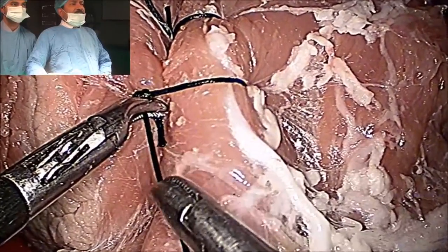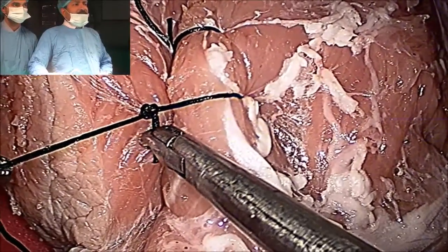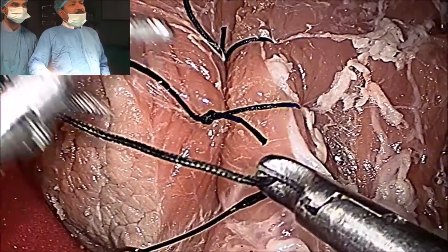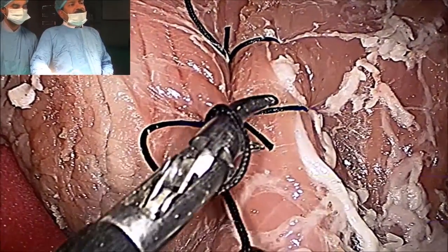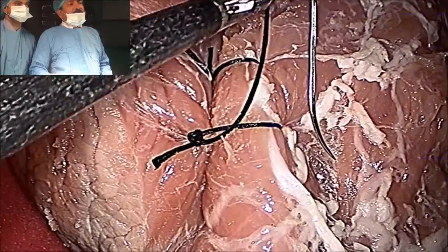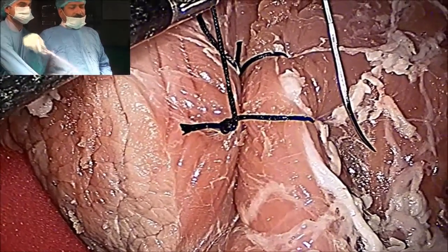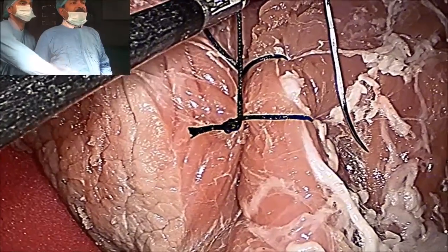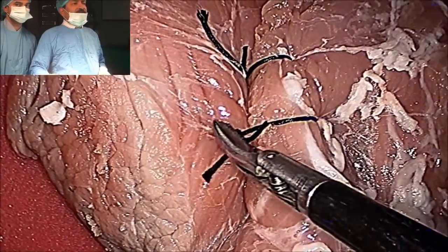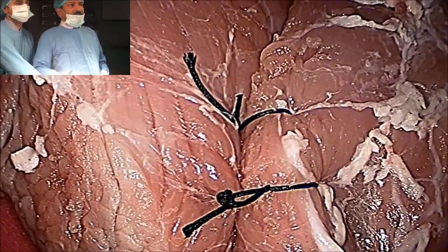It is a tight end. If you want, you can do further tightening and it is fully tight. After that you have to convert it into a square knot — this is called untumbling. Then finally you will lock it once more, and here this is the final lock. So this is the tumble square knot — it is particularly very useful for tissue which you want to approximate and which is under tension. This is called the buttock sign, to obliterate the dead space in myomectomy or to approximate the edges of the duodenum. So this is the tumble square knot, and here the tissue under tension is approximated. Thank you very much.